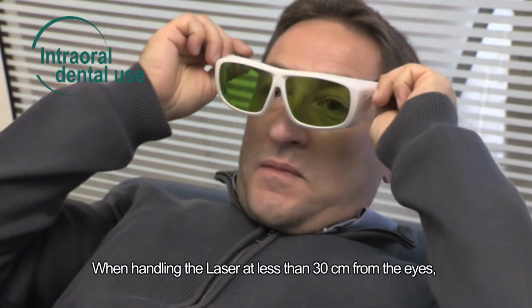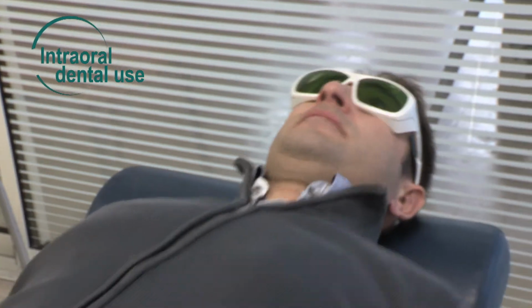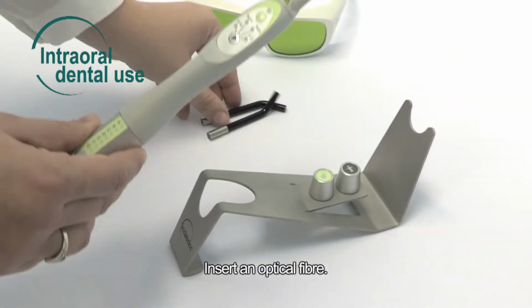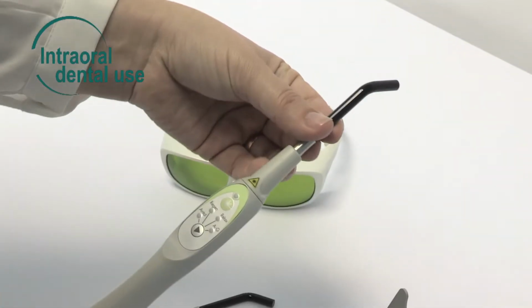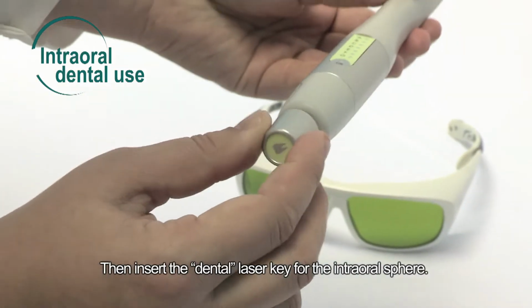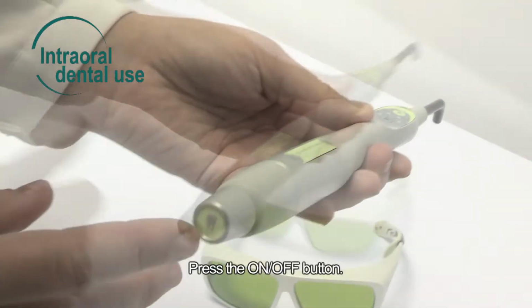When handling the laser at less than 30 centimeters from the eyes, the patient must wear protective goggles. Insert an optical fiber. Then insert the dental laser key for the intraoral sphere. Press the on-off button.